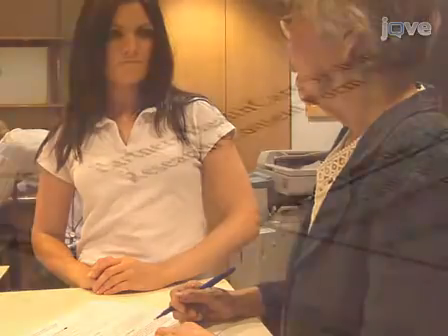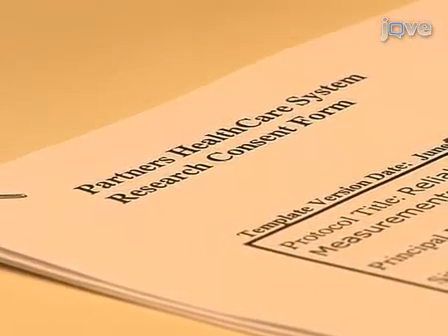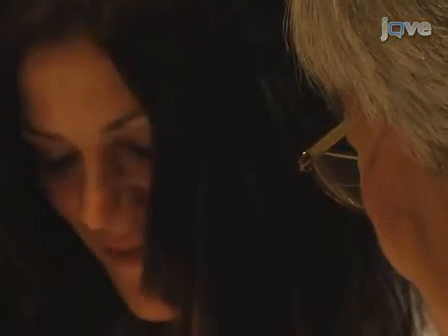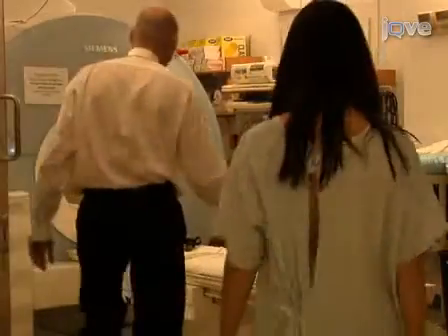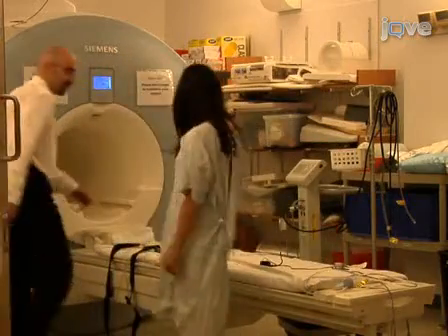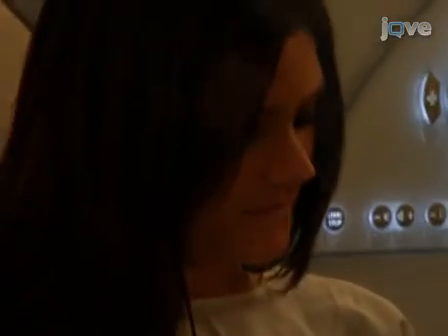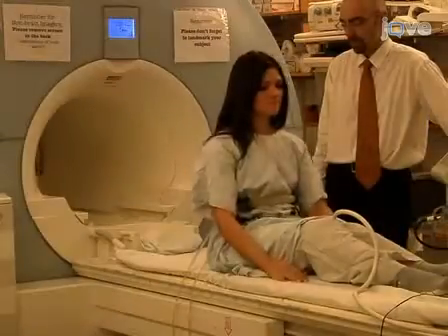Before you begin, make sure that the subject is not anxious or fatigued and has eaten a light meal prior to the scan, as this can affect the brain response to acupuncture stimulation. Bring the subject into the scanner room and have them insert earplugs to protect their ears from the noise of the scanner. Now place the subject onto the scanner bed and use cushioned supports to immobilize their head.